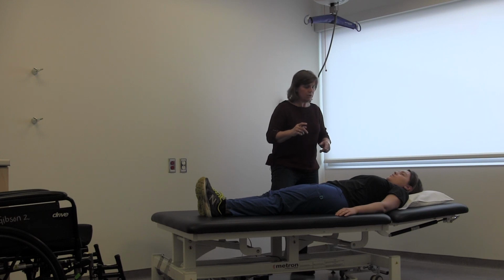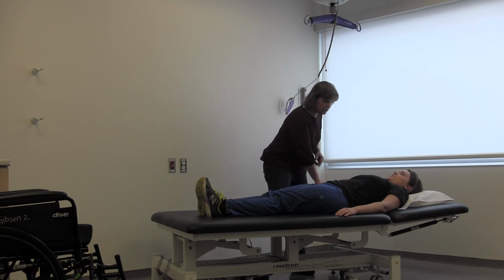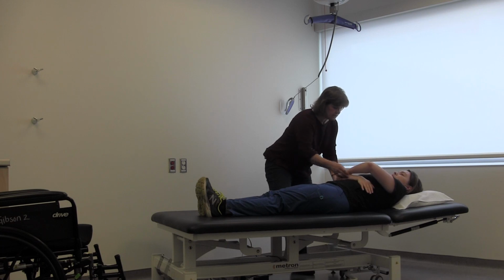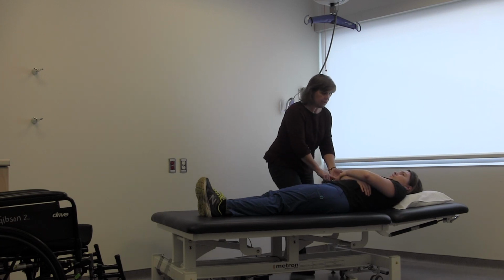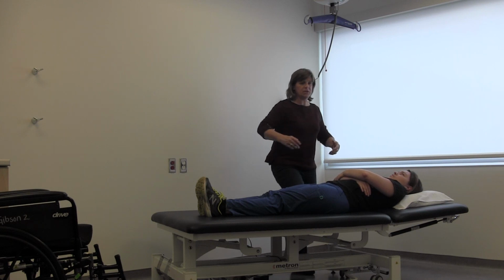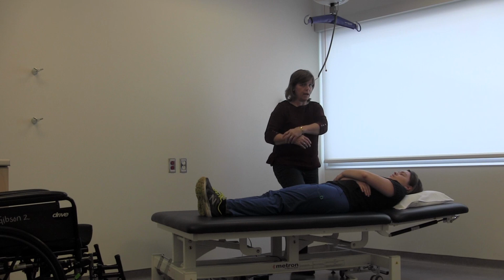So to help her, we're going to say this is her right side. So Annette, can you reach up and grab your right arm? Now, if she can't, I can certainly help. And then that's it, perfect. So we're going to have her hold at her elbow, at the forearm and elbow. A lot of our patients, they like to reach over and grab the hand and the wrist, but the arm is actually quite heavy. So when you bring it over, they can pull at the wrist and actually cause a lot of pulling and discomfort. So we ask them to hold at the forearm and the elbow.